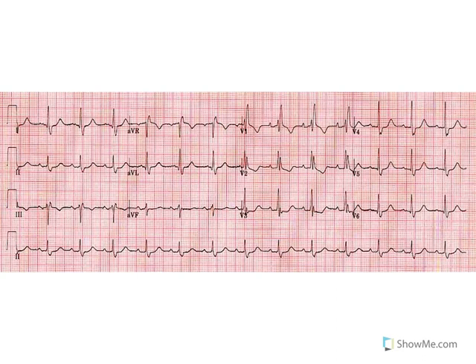All right, so that's what I've got. When I look at my right bundle branch block, mostly upward deflection in V1, especially when I go from the J point backwards. And then in my lead 1 and V6, I should see S waves. I should see pretty good looking S waves there. And once I've got that, I know this is in fact a right bundle branch block.